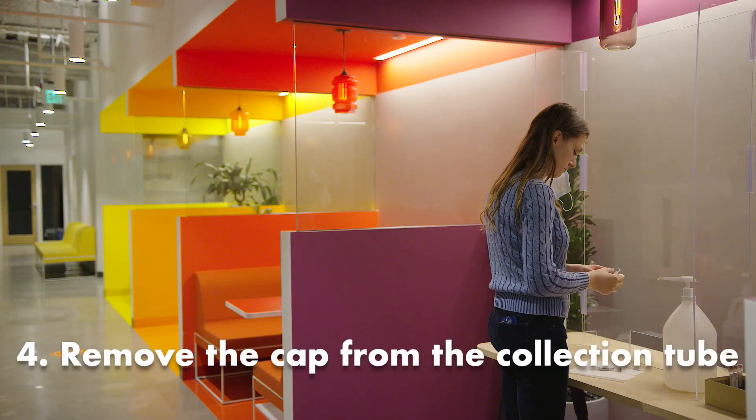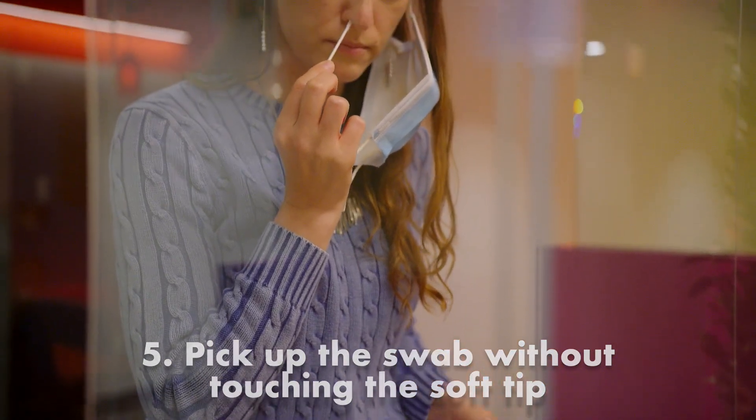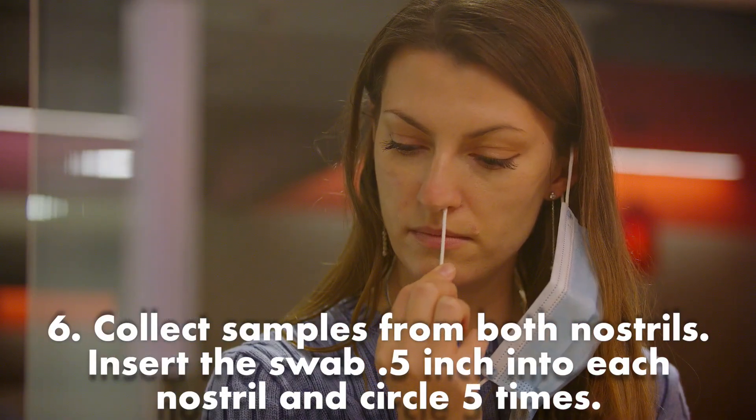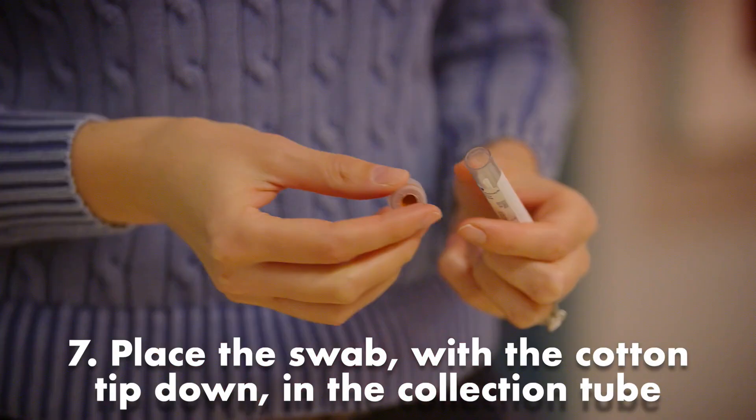Remove the cap from the collection tube, pick up the swab without touching the soft tip, collect samples from both nostrils, and place the swab with the cotton tip down in the collection tube.